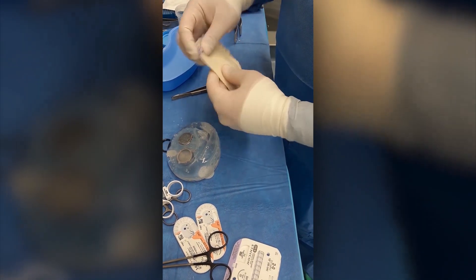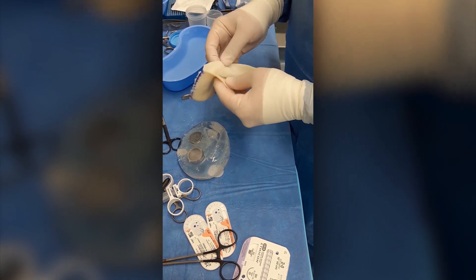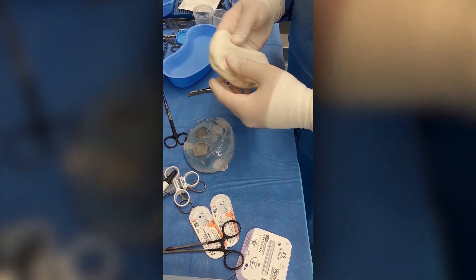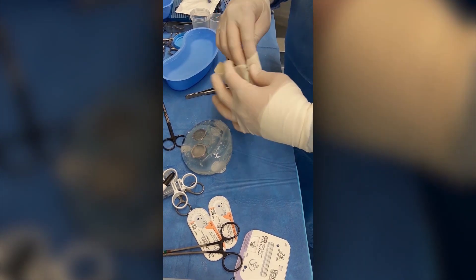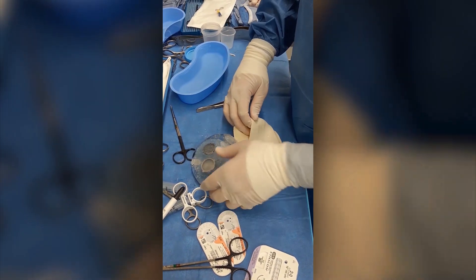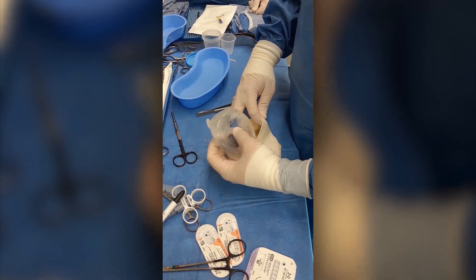So here I've sewn this and now remember the surface I want on the outside I've kept here intentionally so that when I flip it, the seam is internalized and I've made basically what I call a pita pocket. I'm going to use this pita pocket to wrap around the expander.